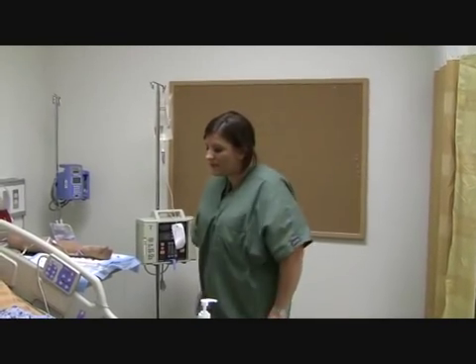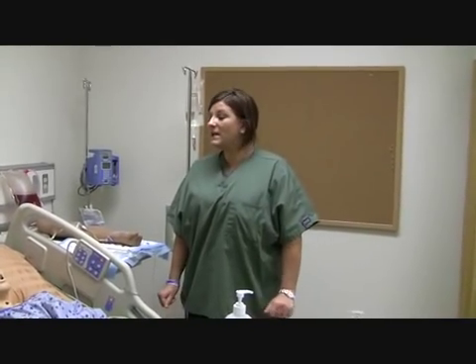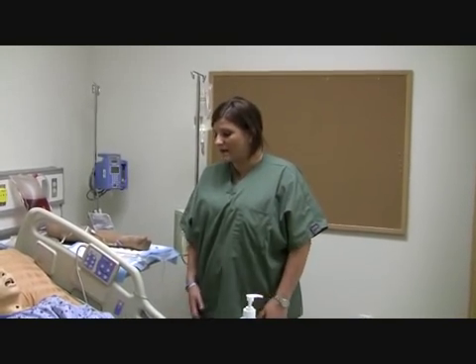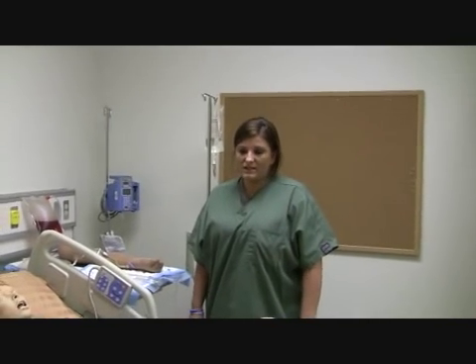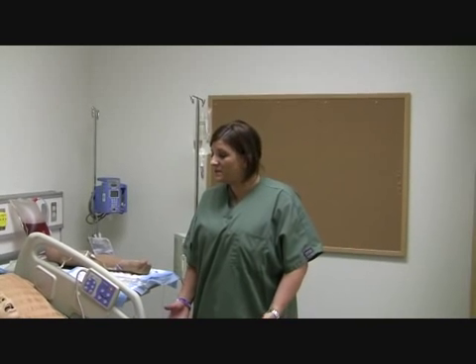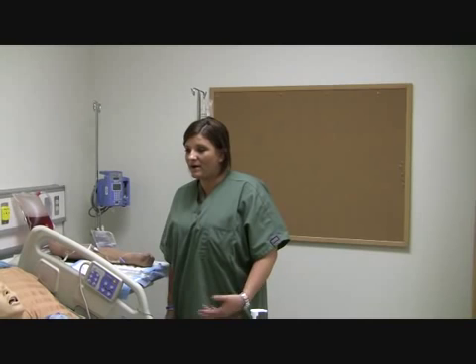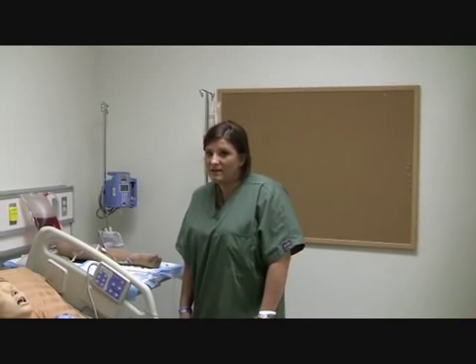So we're going to go ahead and tell Jane, we're going to give you some packed red blood cells. It looks like they think there might be some bleeding, so we're going to get your blood cells back up so we can make you feel better. And if you need to use the bathroom at all, you might be here for a while. If they didn't have a catheter, they'd probably want to go and use the bathroom, because it could take up to 4 hours to hang the blood.